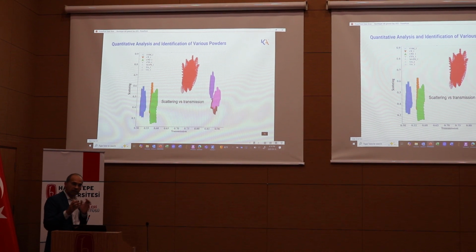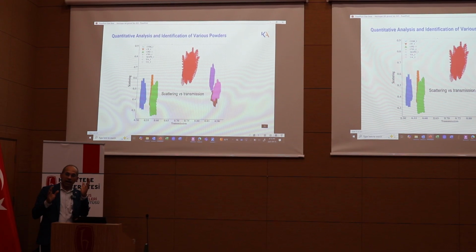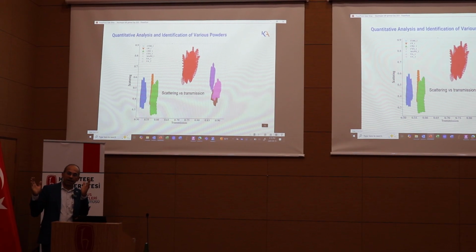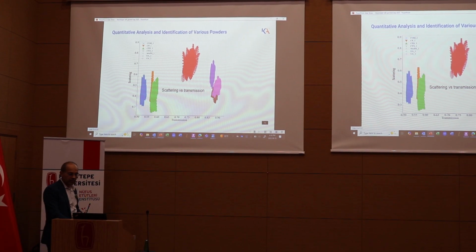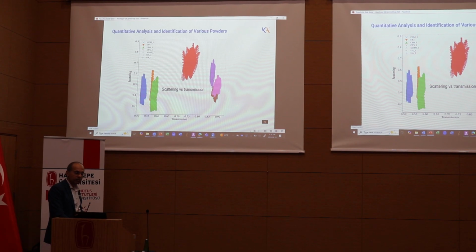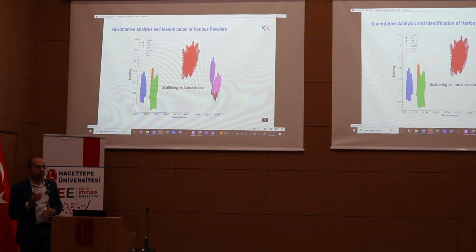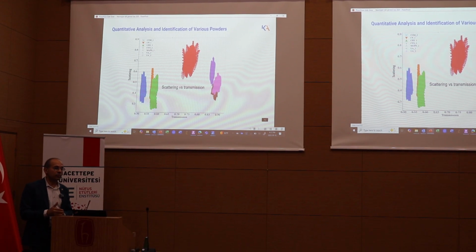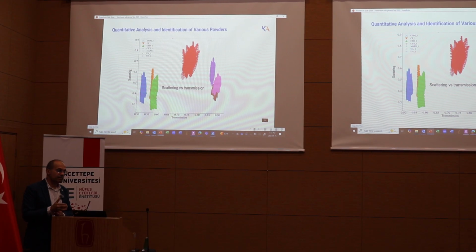So with a regular X-ray, I can separate by attenuation uric acid from calcium. What I cannot get is magnesium, because magnesium has the same attenuation as uric acid. So if you use a conventional CT to diagnose the type of kidney stone, you would miss magnesium.